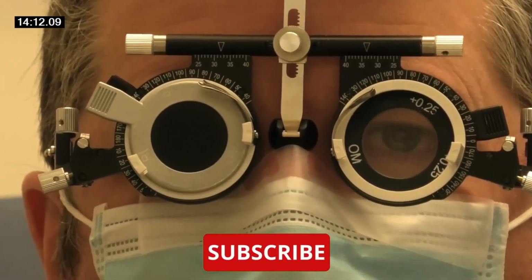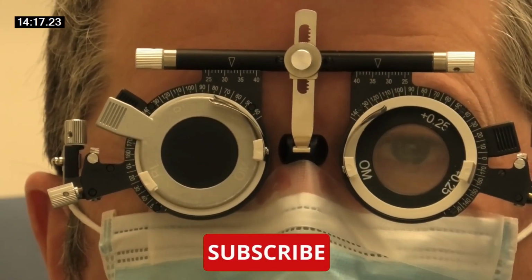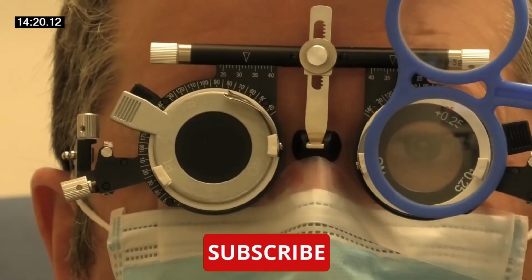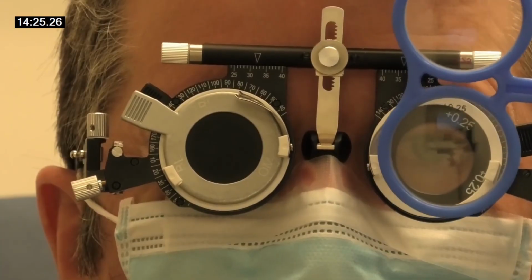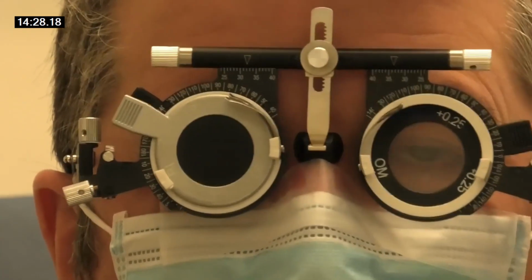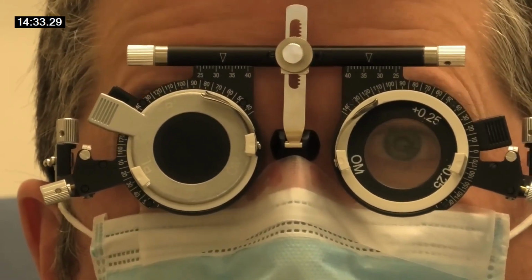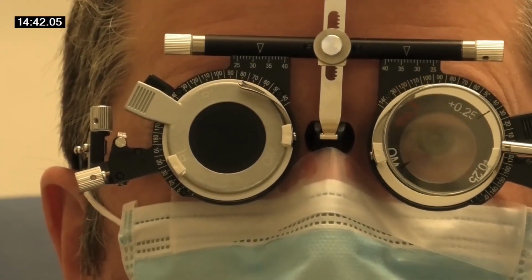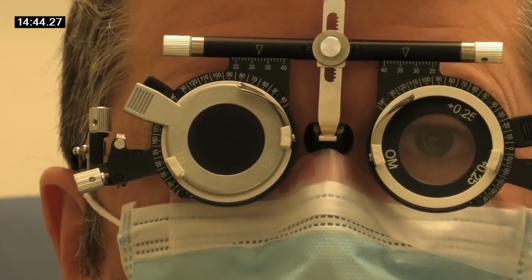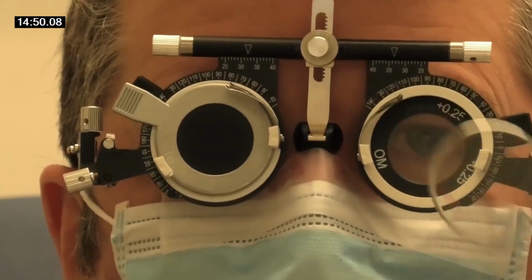So just looking at the Z again, is that clearer with this lens, without, or about the same? With? About the same. About the same. And what about now? It's clear without, I think. Clearer without? Yeah. Okay. Okay, so just looking at the circle there, is it clearer with lens 1 or lens 2? Two, yeah, two.